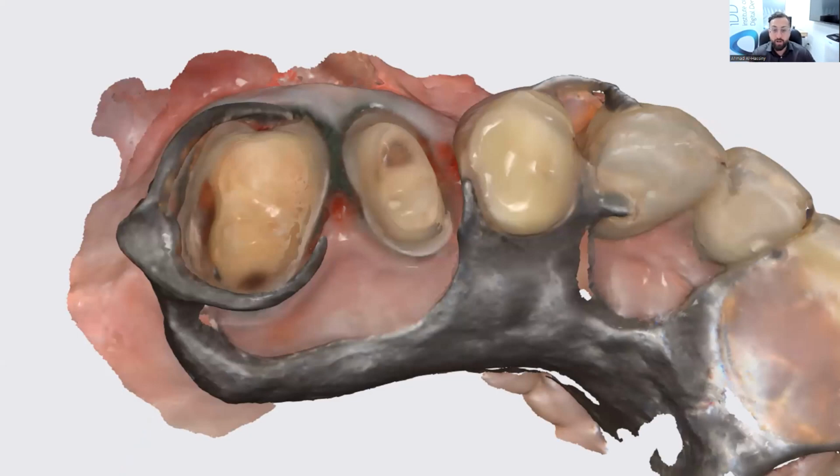Fitting crowns to an existing partial denture traditionally is exceptionally annoying. You have to take the denture away from the patient, send it to the lab, whereas with a digital scan, it's super easy. But you do need to train. You need to understand, how do you do this? A lot of people think scanners can't scan metal, but here's an example. I scanned this partial denture, cobalt chrome.